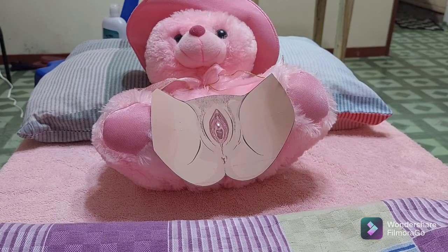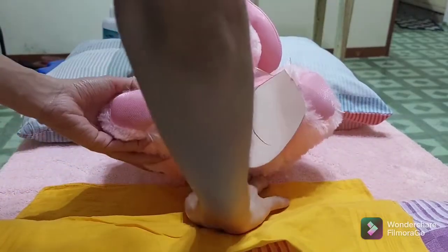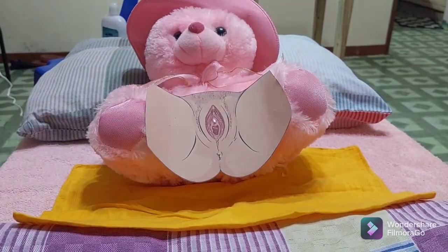Now place the waterproof pad under the patient. This prevents soiling of bed linens. For the positioning of our patient, it depends on their gender. For a female patient, on back with knees flexed and thighs relaxed so that hips rotate to expose the perineal area.